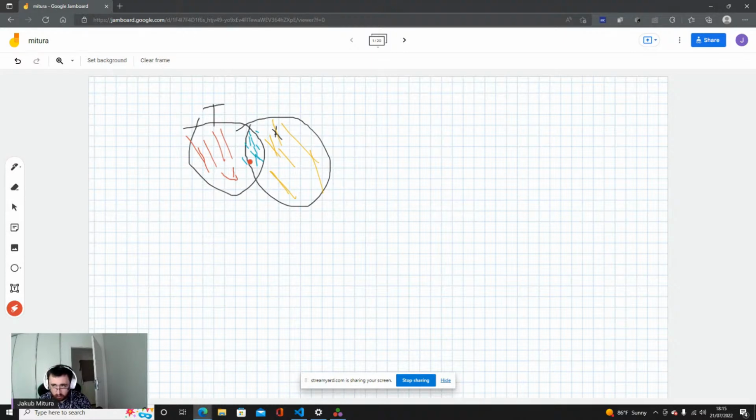What is important is that they do not take into account the distance. From the perspective of the dice score, whether the mislabeled voxel is distant or close is the same. In order to take into account the distance, we need some distance metrics, like this Mahalanobis distance.